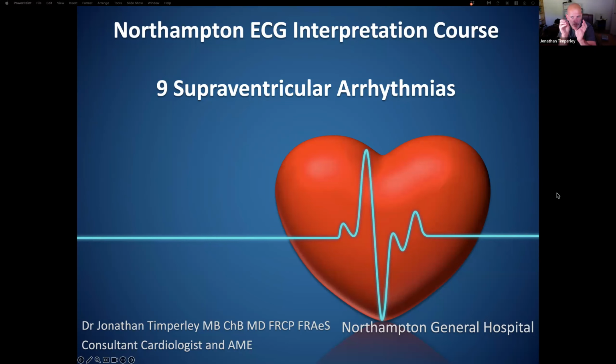So I've got some stuff here that I'd like to go through, which includes specifically supraventricular arrhythmias, and then we've got some clips on how we get things like AV nodal re-entrant tachycardia and AV re-entrant tachycardia.